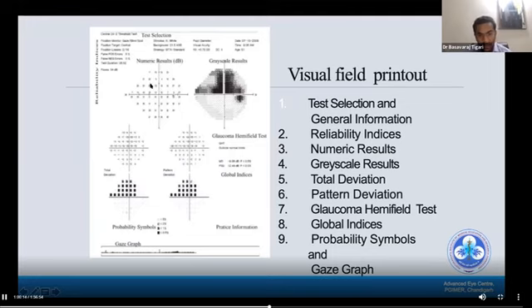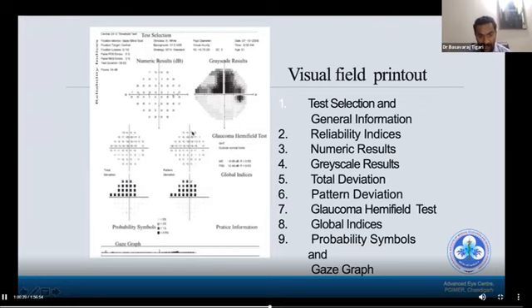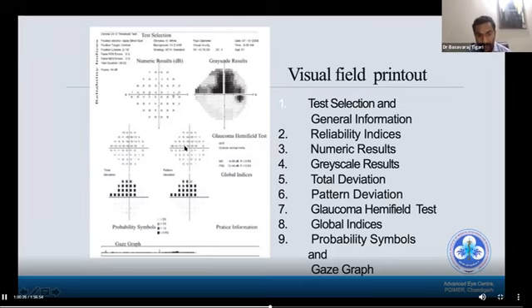The numerical results include the grayscale and total deviation. The grayscale is a pictorial representation, the total deviation has both a numerical graph and a pictorial graph. Similarly, pattern deviation has a numerical graph followed by a pattern deviation plot as a pictorial explanation.